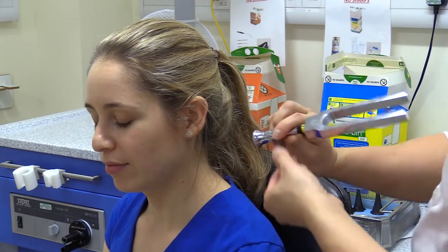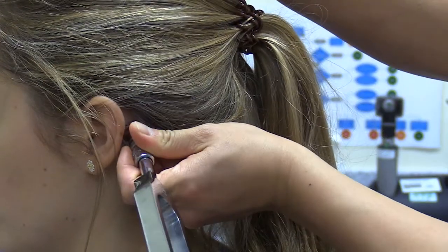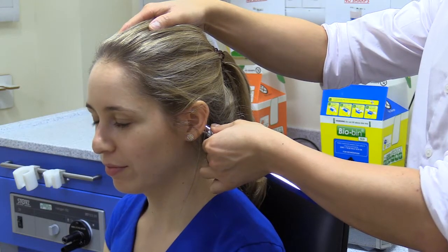Hold the tuning fork in front of the ear to test air conduction, then press it on the mastoid to check bone conduction. Support the patient's head with the opposite hand to ensure firm contact and therefore sound transmission through bone.